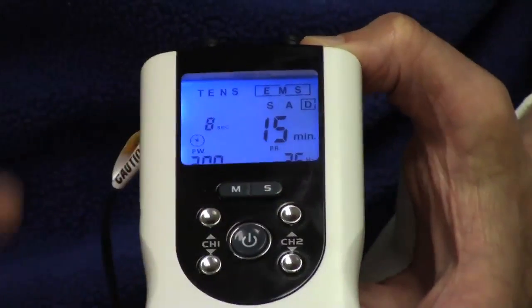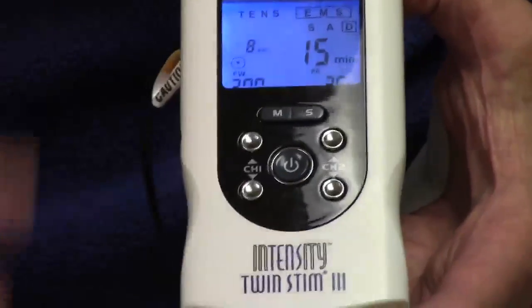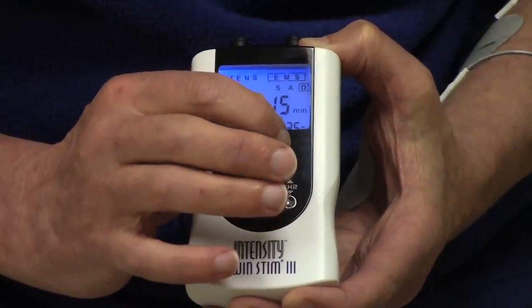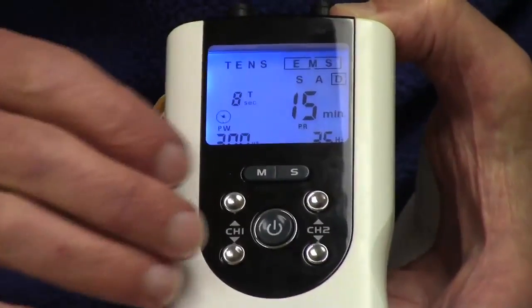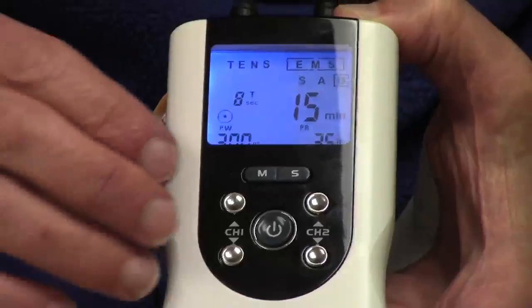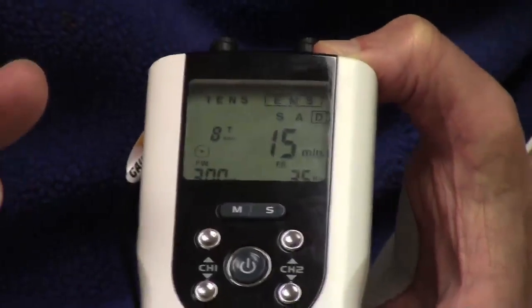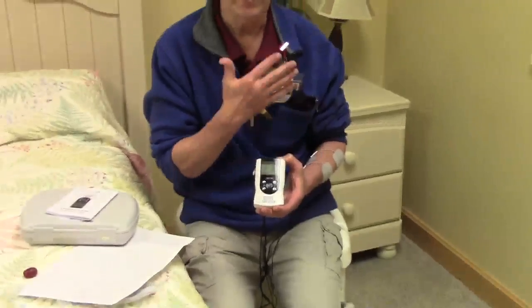I press S and the T is flashing — I want the rotation to be about eight seconds, so I use the up or down arrows to set it to eight seconds. Press S again and the clock is flashing — here I set how long the treatment session is. Usually the first session is about 15 minutes; if things go well you can increase that by five minutes at a time. The more stimulation the better. The benefit of electrical stimulation is it will prevent the muscle from getting too weak from lack of use, it will help with swelling, and it will help with the brain-muscle-nerve reconnection, which is what you're looking for.